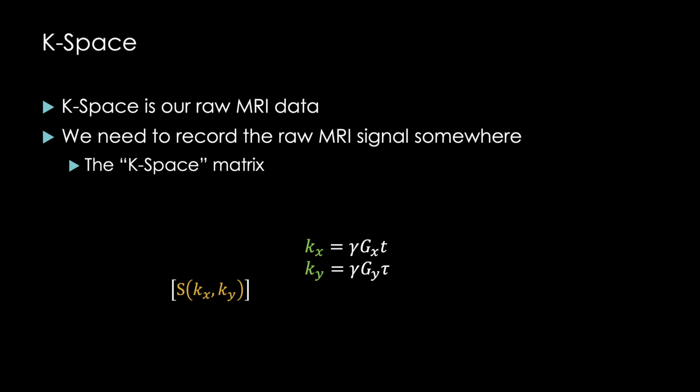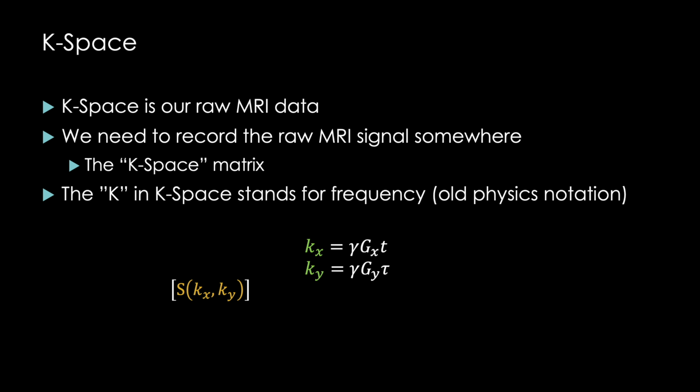Now you also might ask, why do we use the letter K? The K in K-space stands for frequency, which comes from old physics notation. Not intuitive, just the way the cards have fallen.